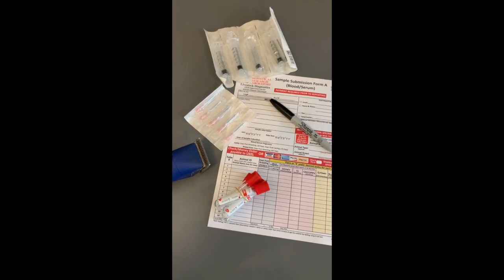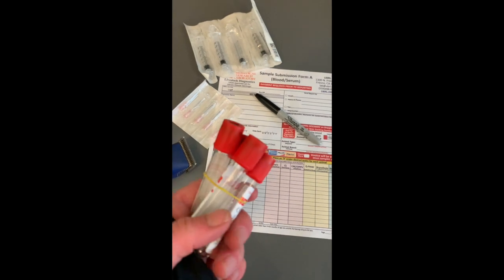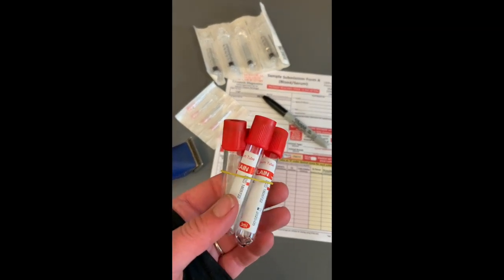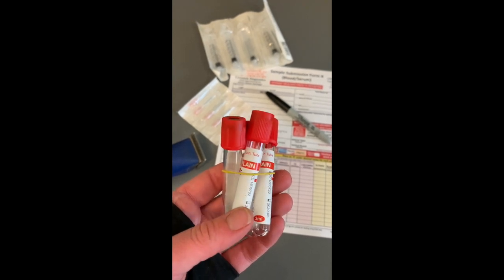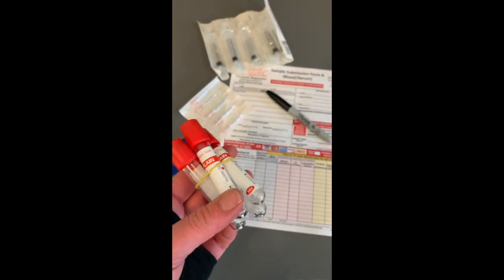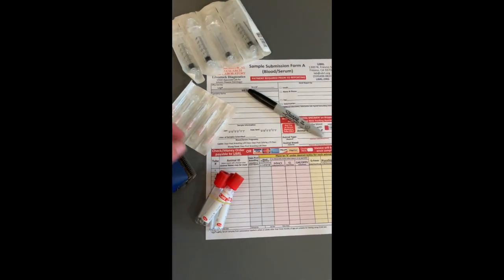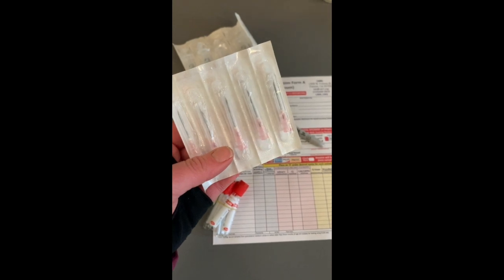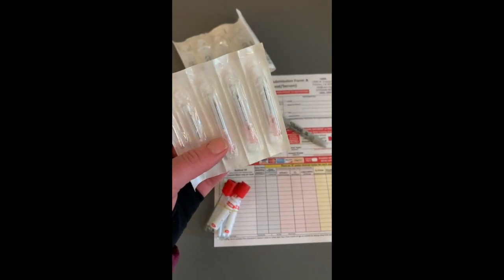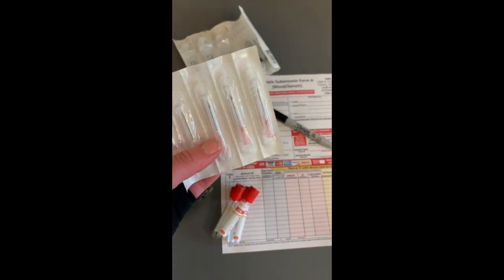So these are the supplies that we have on hand. The first thing you're going to need are submission vials — the red top. We buy these directly from the lab in bulk and have them shipped to us and keep them on hand. They don't really go bad so I buy a lot at once. For taking your blood we like to use 18 gauge needles — these are one inch long 18 gauge.